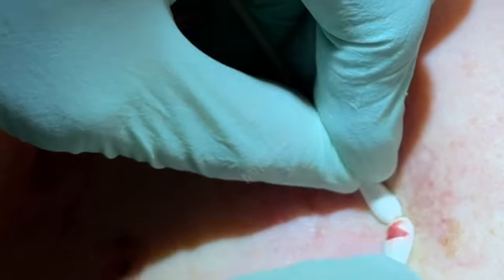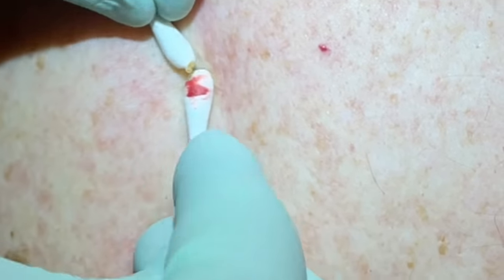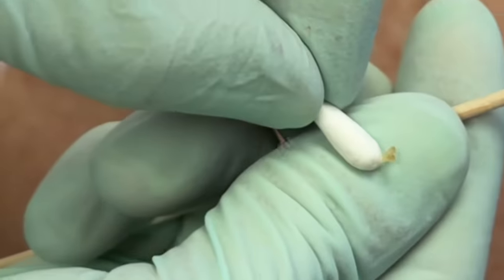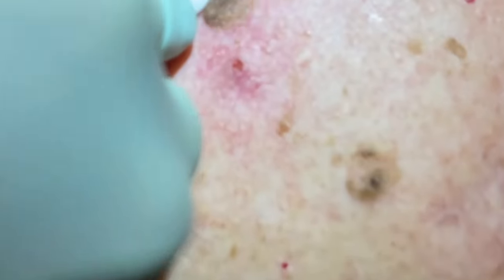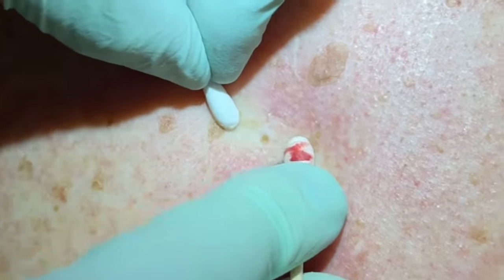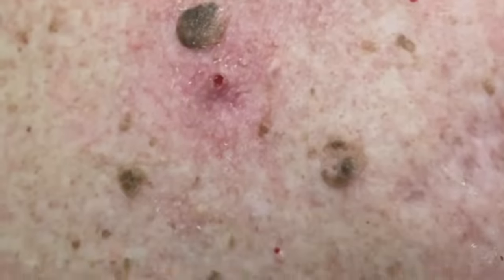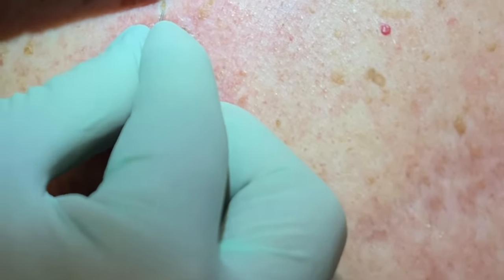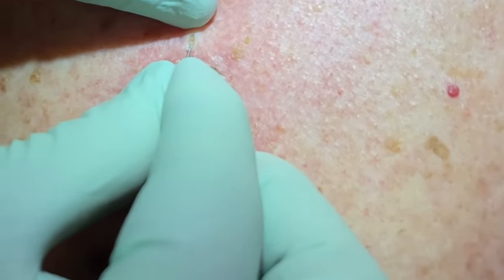Right here — good — just little tiny ones. Another one here. Those little ones look like little twins. Over here this is just a seborrheic keratosis — we call them barnacles of life — wart-like growths that can be itchy. Nothing to worry about; sometimes people are scared it's melanoma because they're darker. Here's a deeper one — we're going to get that out.